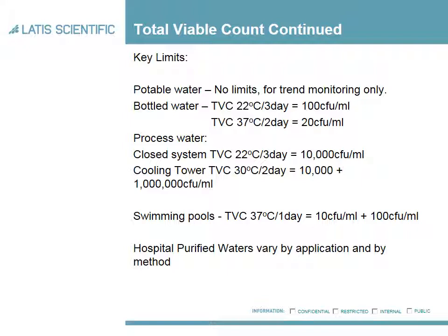In hospital purified waters, so these will be waters used for instrument washer disinfectors, endoscope reprocessing, and preparation of dialysis fluid, the limits vary by application and by the method you use, because there are a couple of slightly different methods you'd use for it.